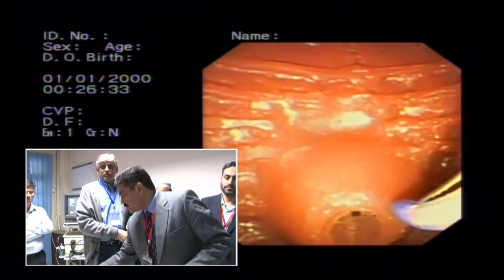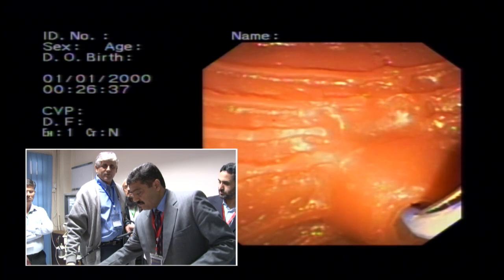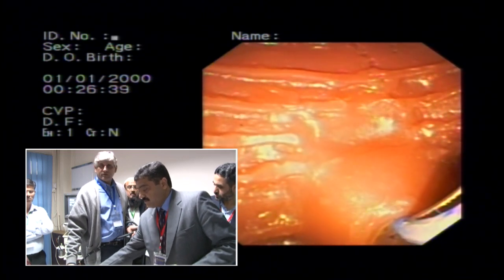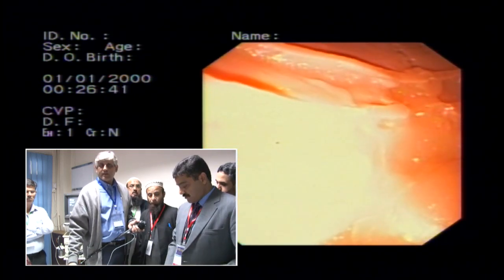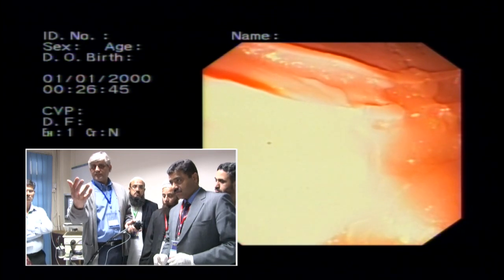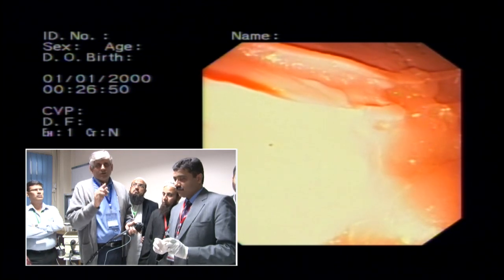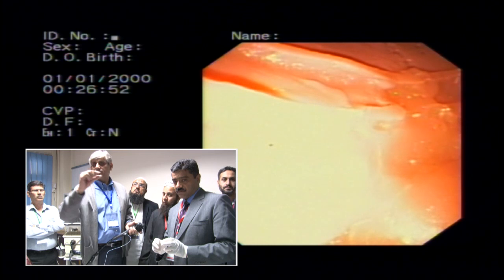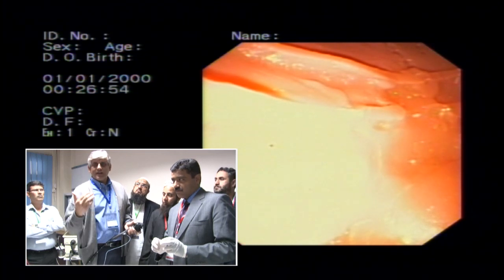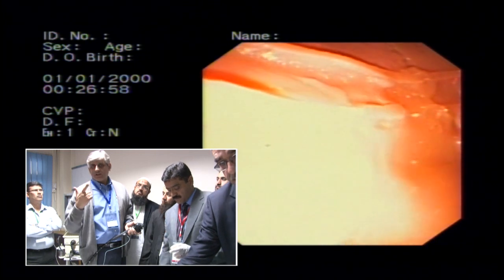But the movement that I do is this: you've got this, you pull back, and at the same time my wheel goes left. Okay, and just a little pull. So what it does is actually the ampulla comes and takes the cannula, and it just gives me. I don't push it in. I've only got this much of my cannula in. At that moment, I asked my technician, try the wire.